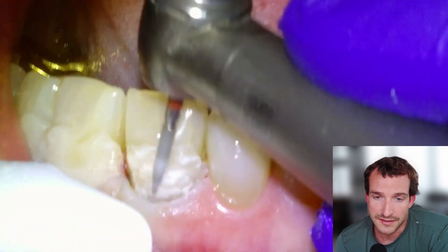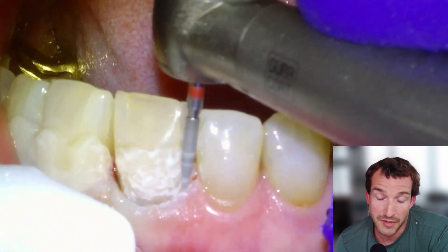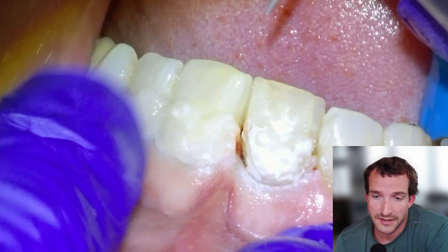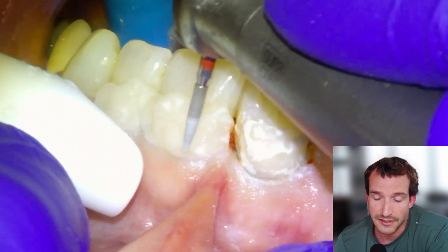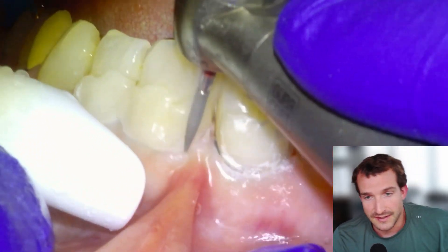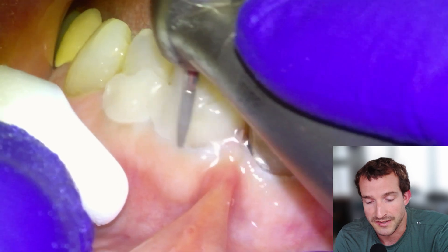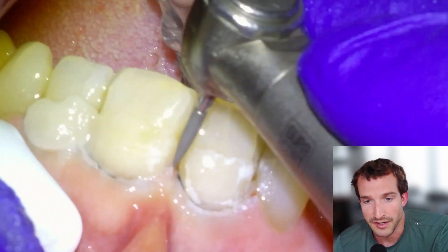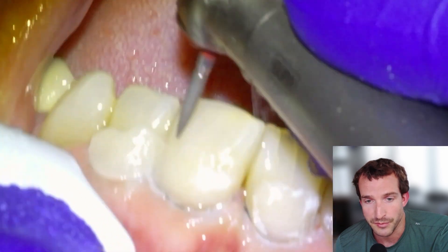It doesn't leak — it has a much more intimate bond interface than composite because it's chemically bonded to the tooth. This is going to look a lot better than composite right off the bat, it's going to last longer, it's not going to fall out or leak, and it's going to look the same in 10 years as it does the day it's placed. We'll finish trimming here — this is definitely the most tedious and time-consuming part of the procedure.